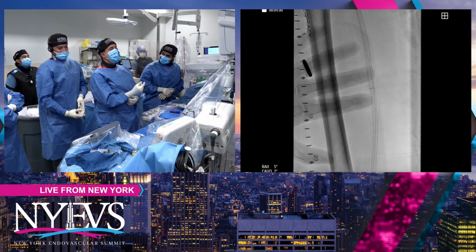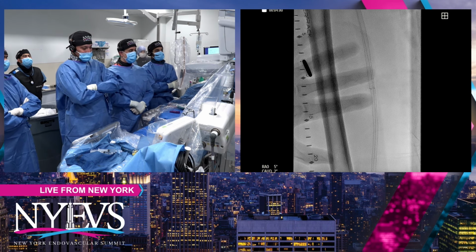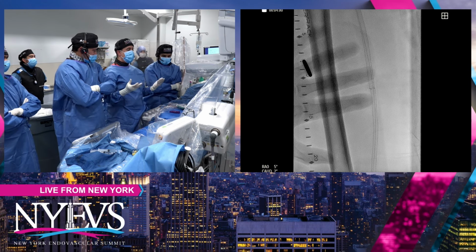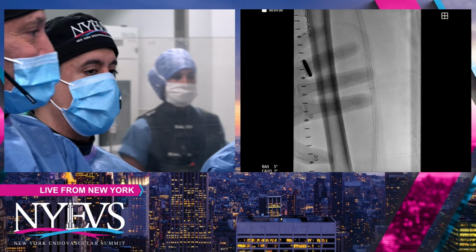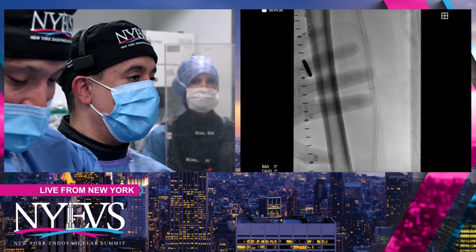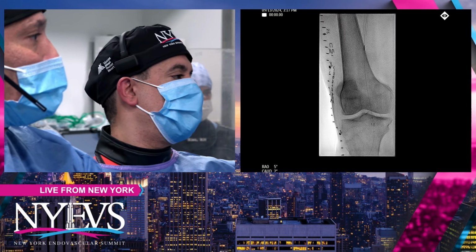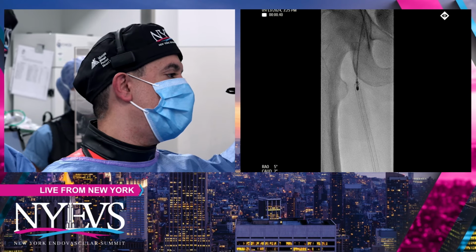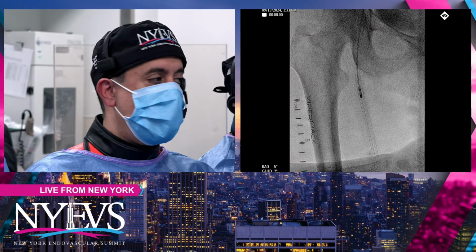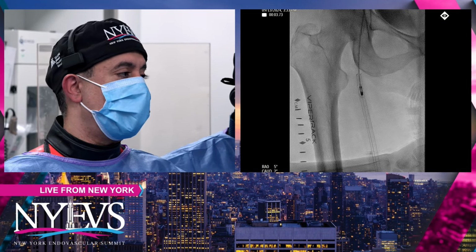I really thought you knew the answer. So in this case, we decided to do a Rotarex, like Dr. Zeller talked about, using both the atherectomy, but mainly the aspiration thrombectomy part. And because we had an 8 French in, we had the liberty of using an 8 French Rotarex. And as predicted, because of the significant suction of the device, we were able to do the proximal edge, but as Raman went almost to the mid, it would literally get stuck, and the stent would essentially collapse on the device itself, and it would stop. It was pretty much stalling.